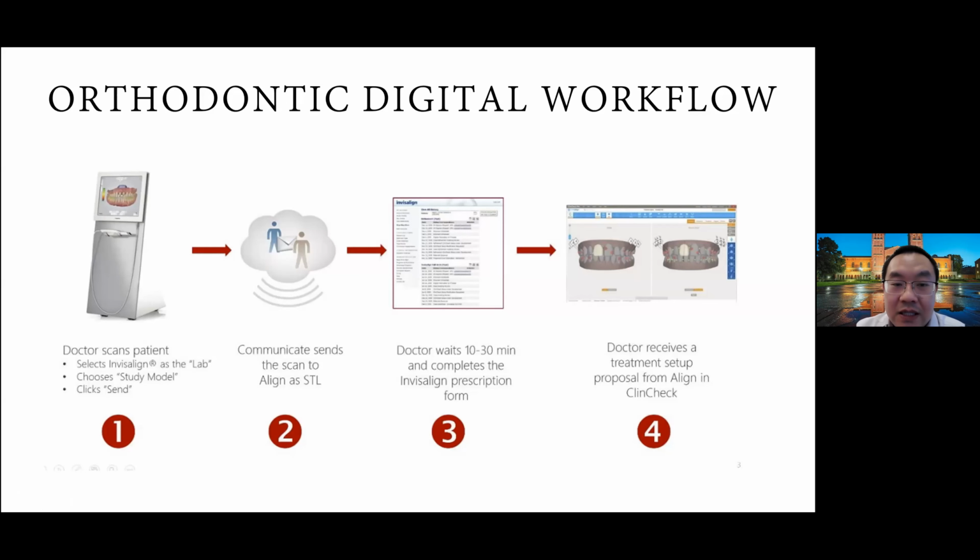Of course, if you're a general dentist who is interested in becoming Invisalign certified, you can also do this too. So if you already have a scanner in your office, you should have the hardware available. You just need to probably get an additional module to be able to do aligner systems too. Okay, and that's pretty much the cost, right?